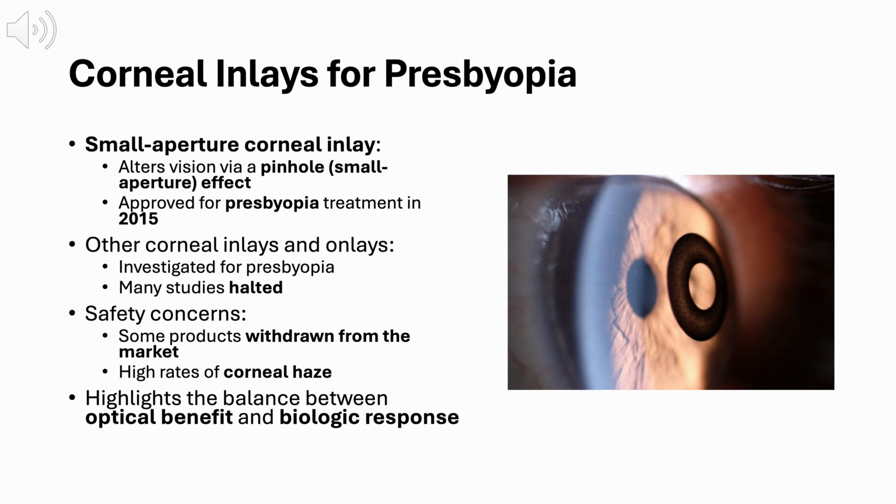Other corneal inlays and onlays were also investigated for presbyopia, but many of these studies were eventually halted. The major limiting factor wasn't optical performance alone, but safety. Several products were withdrawn from the market due to high rates of corneal haze and other biologic responses. Taken together, corneal inlays highlight a recurring theme in refractive surgery. Achieving optical benefit is only part of the challenge. The long-term biologic response of the cornea often determines whether a technology ultimately succeeds or fails.